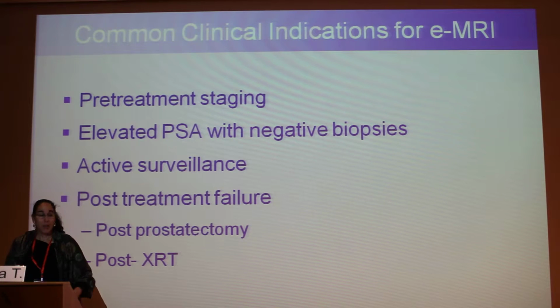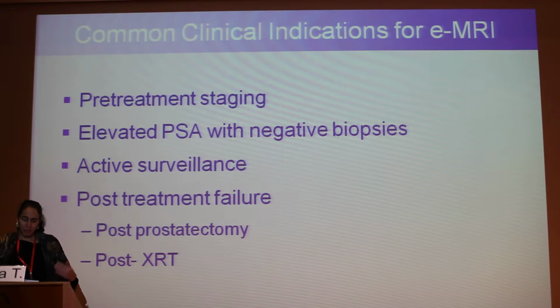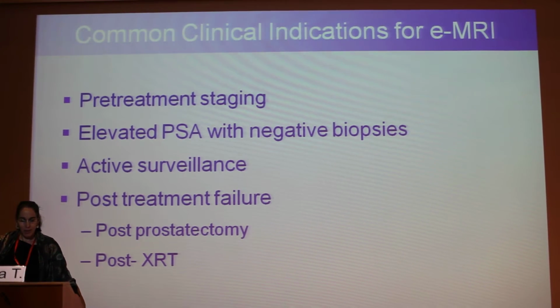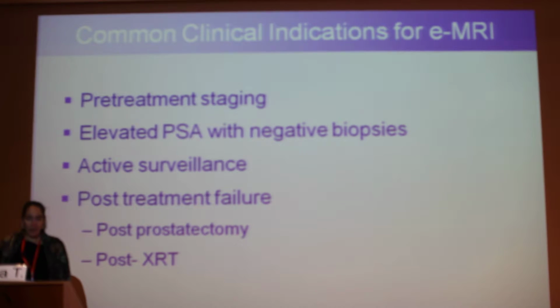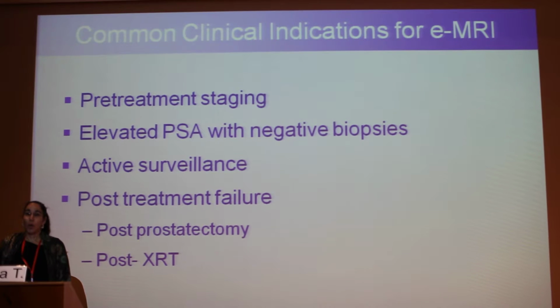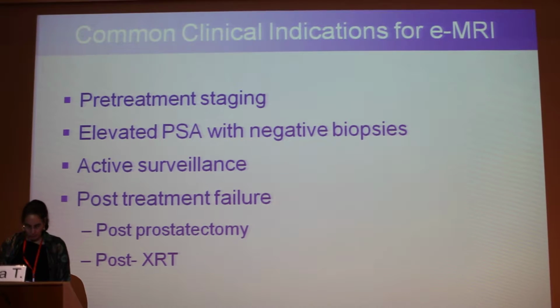So let's begin. Like Ovid mentioned priorly, the main clinical indications of prostate MRI today are pretreatment staging, evaluation of patients with elevated PSA and negative biopsies, active surveillance before or during active surveillance, and evaluation of suspected post-treatment recurrences.